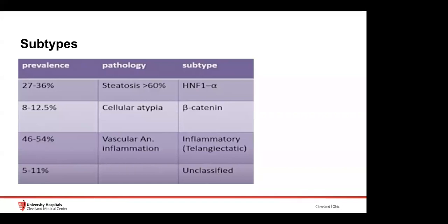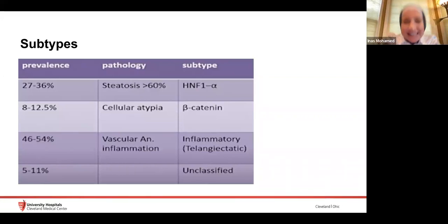Okay. So EOVIST is a hepatobiliary agent. What it does is the liver deals with it like bile, imagine that this is just bile.